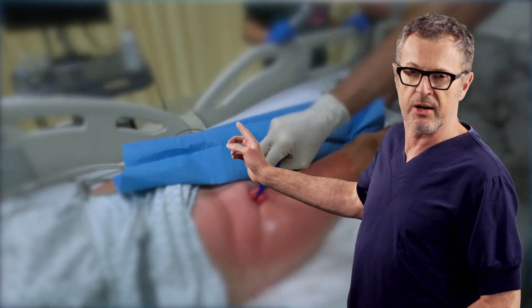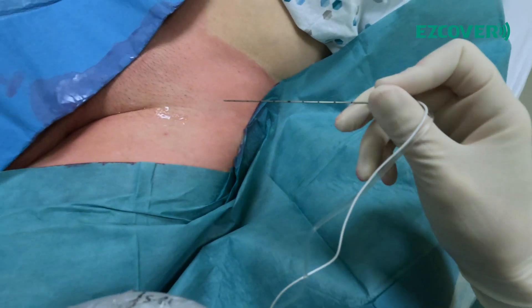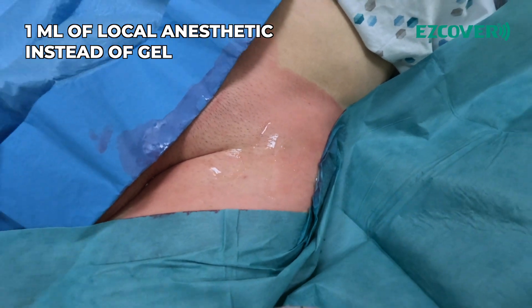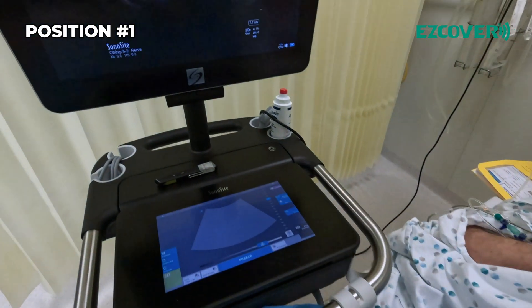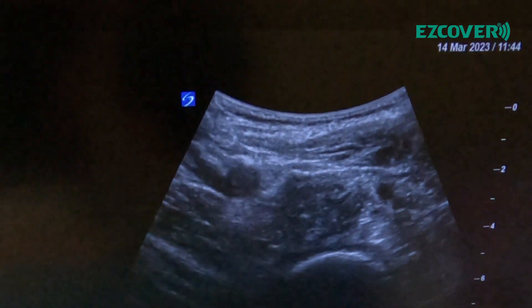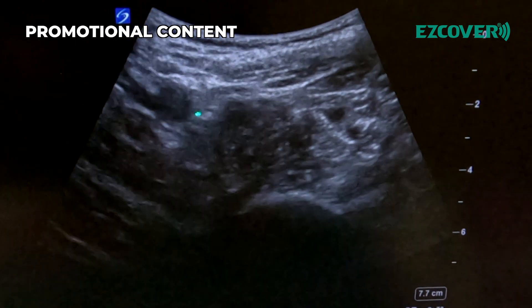Let's get started with the first pain block for analgesia in a patient having total hip arthroplasty. We need to see the femoral artery and the nerve — and there they are: femoral artery and the nerve.